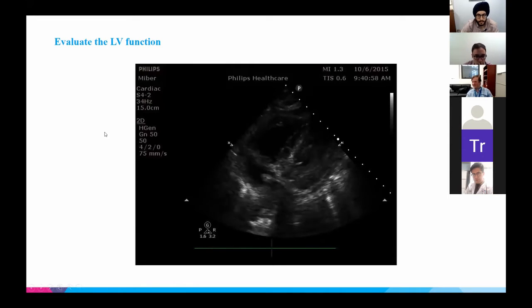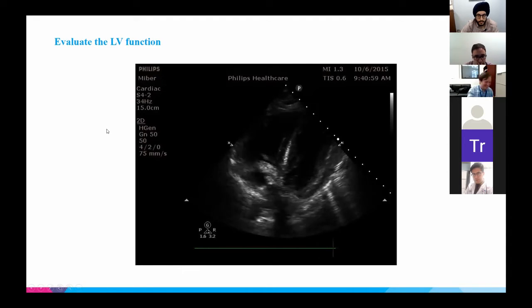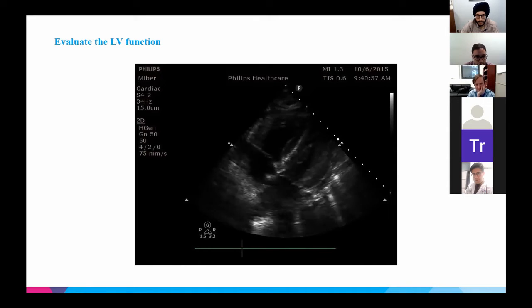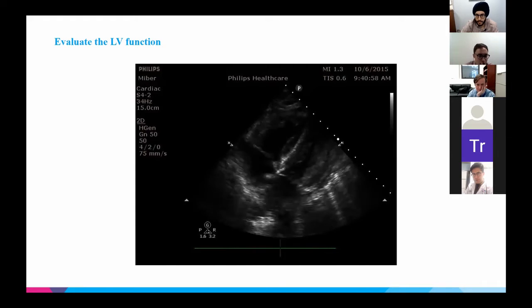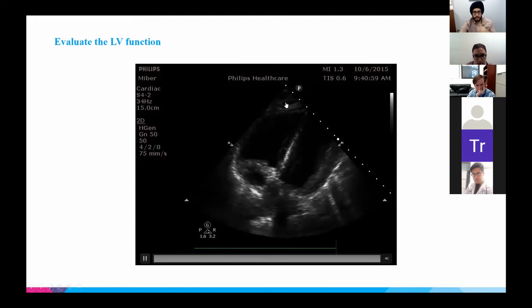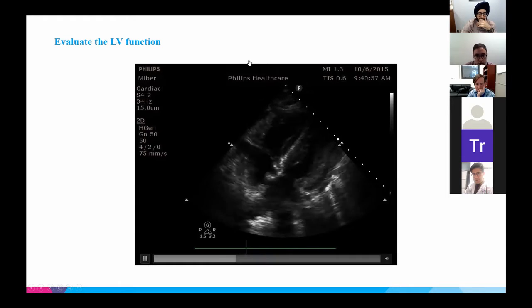And then, so what are we looking at here? What view, I should say? Yeah, so I would say this is a bit of an off-axis apical four-chamber view. I know sometimes it can look like subcostal just because the right ventricle looks like it's on top. But my guess is that maybe the person handling the probe was a little bit in the wrong location.